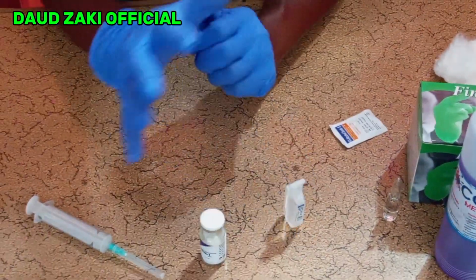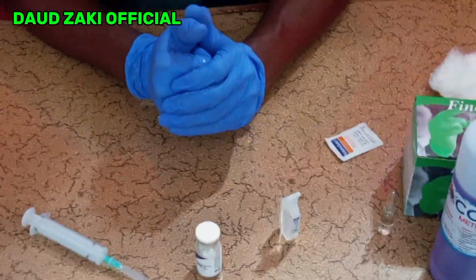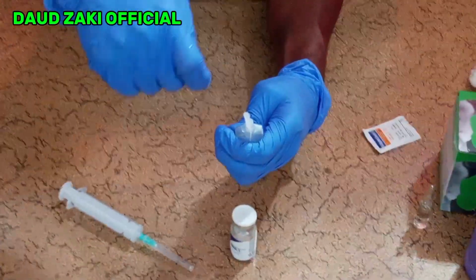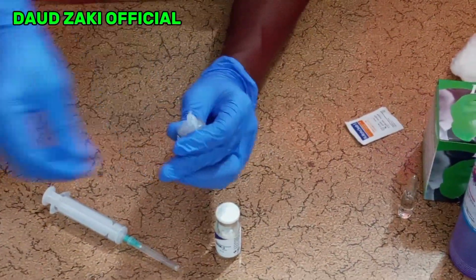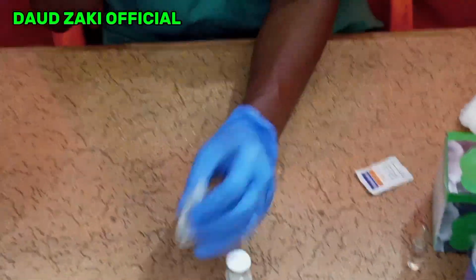So we now need to reconstitute, to dilute the drug correctly to administer safely to the patient. First, you open the plastic vial containing the sterile water for injection. You twist the cap of the plastic vial to withdraw the sterile water for injection.